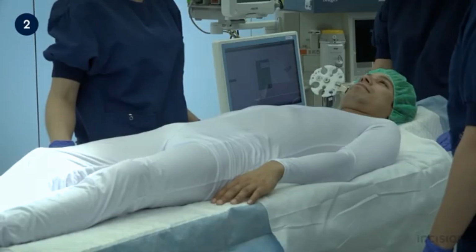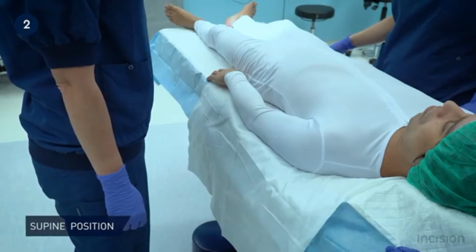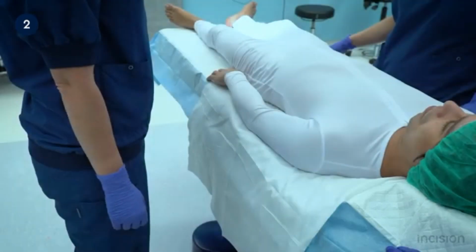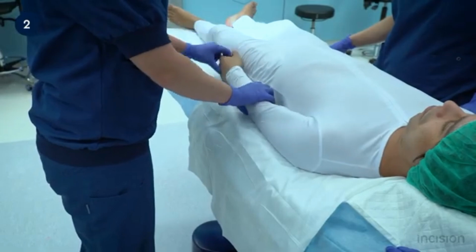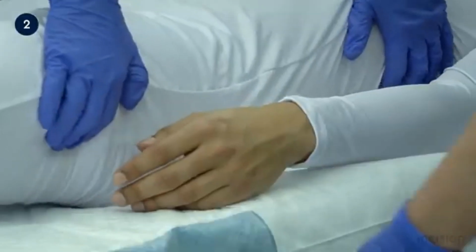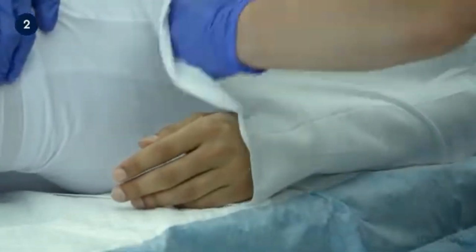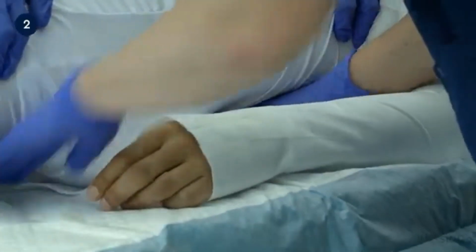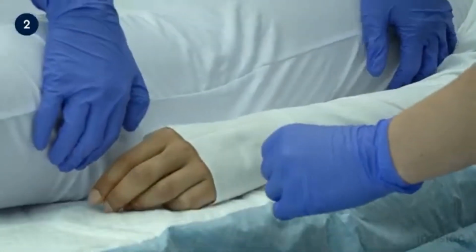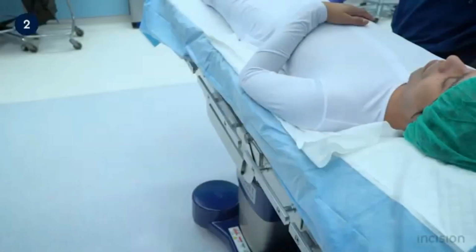With the bed moved and the patient in supine position on the surgical table, they can now be placed in a number of positions. The supine position will be discussed first. In this position, the head is placed on a head support as shown. The arms can be pronated as shown, and the patient slightly rolled away from the arm, and the draw sheet then tucked in between the arm and their body. This is done with care to avoid creases which may cause pressure complications. Care should also be taken not to dislodge IV lines.